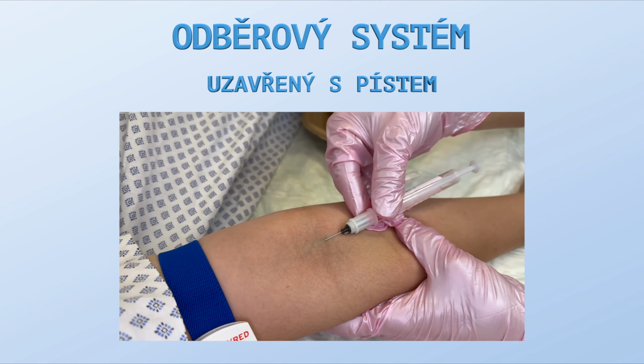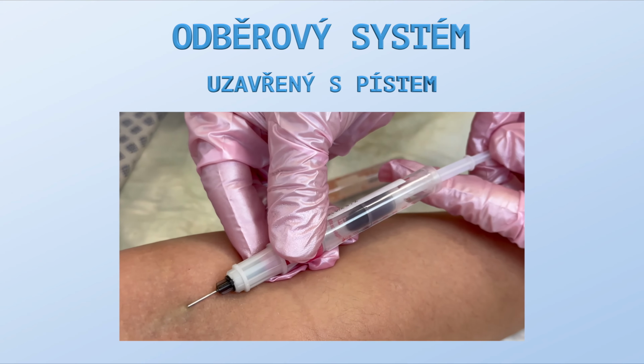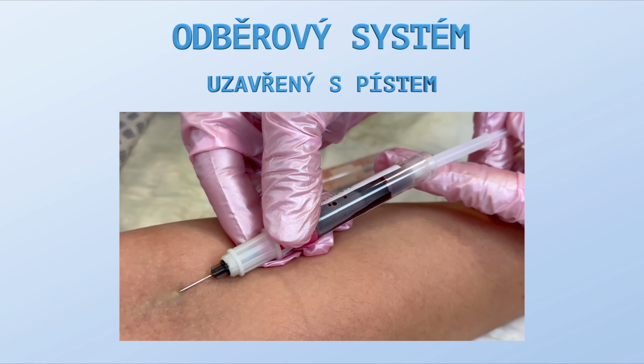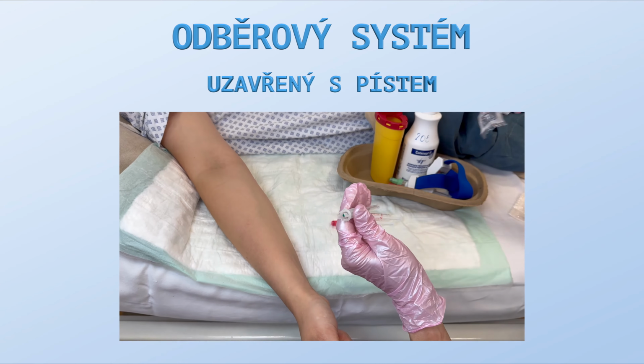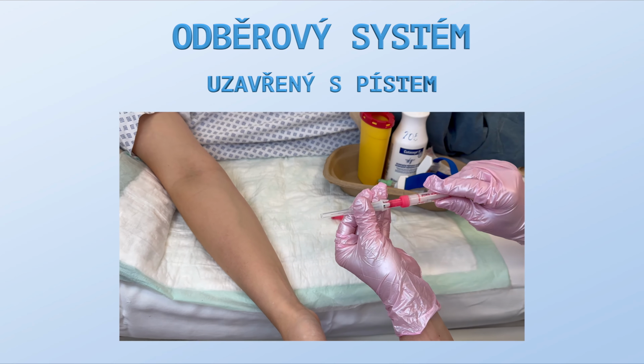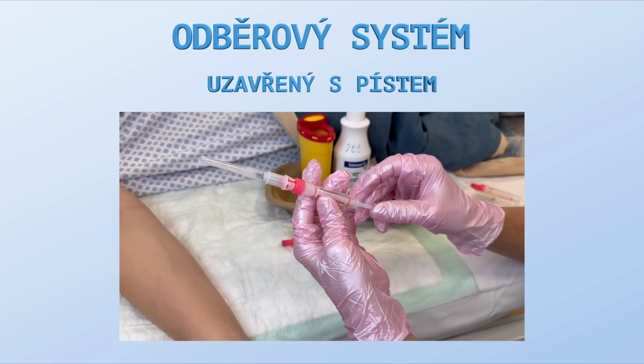The sterile venous vacuum blood collection set's system consists of a sterile collection needle with a locking mechanism, where the sharp metal part of the needle is inserted into a plastic cone that protects the opposite end of the needle. The cone has locking grooves for securing the protrusions of the blood collection syringe.